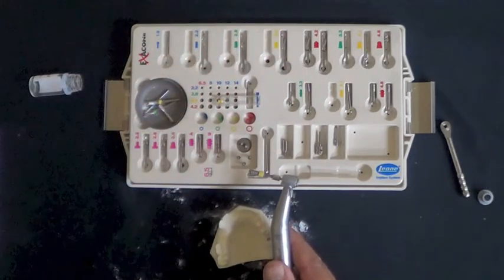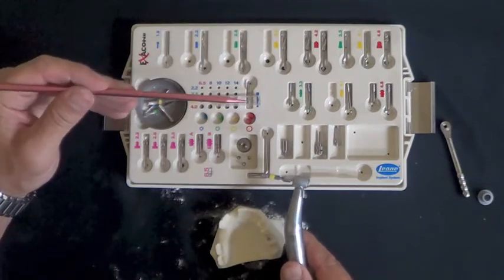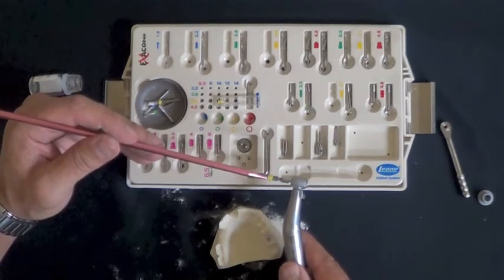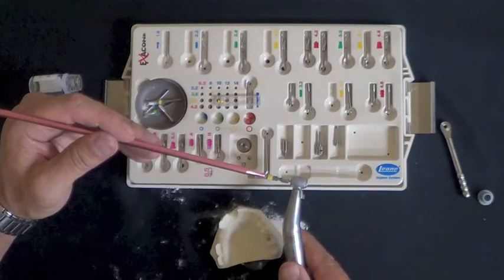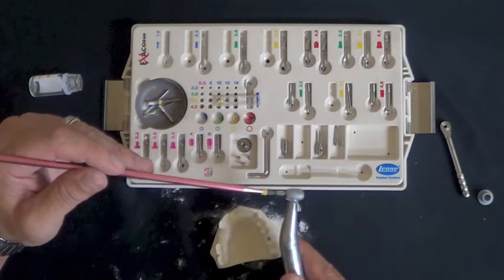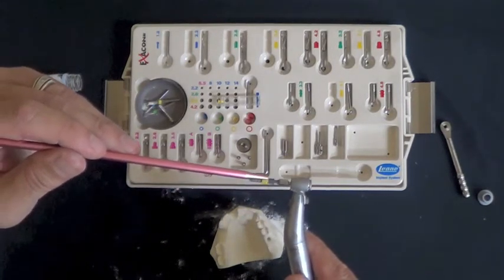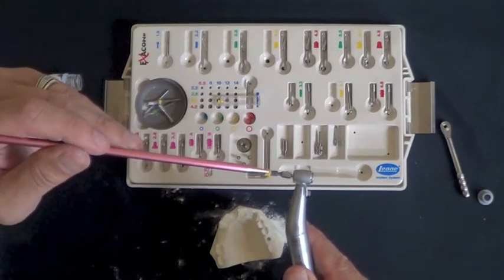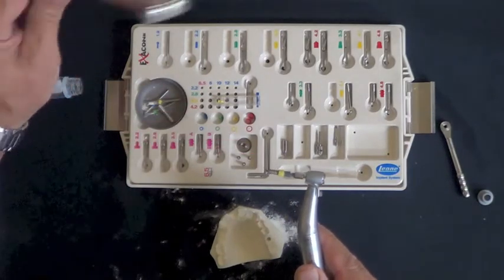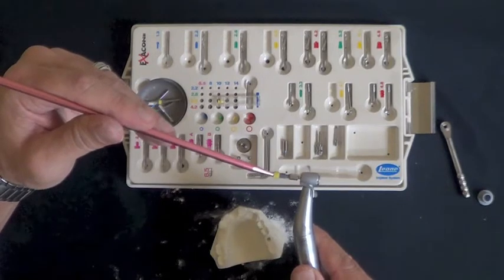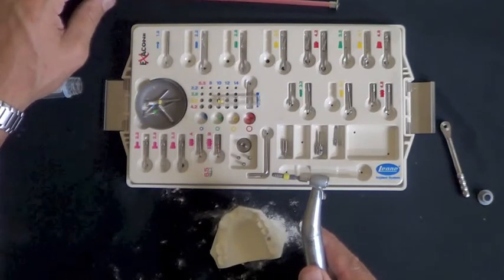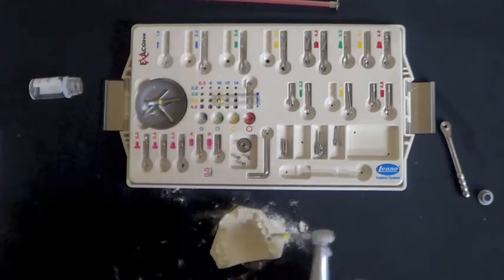You'll also notice since this is an implant without a screw, the carrier or the transfer is attached to the implant by a ringlet that holds the two pieces together. You'll also notice on this ringlet that when this yellow carrier gets driven up to this line above the yellow carrier, it will have the implant placed at the crest of bone. So we'll drive the implant in the site. When this ringlet moves from where it is up to the line just above it, we'll know then that the implant is at crest of bone. And that's where we'll stop the placement if that's our desired depth.